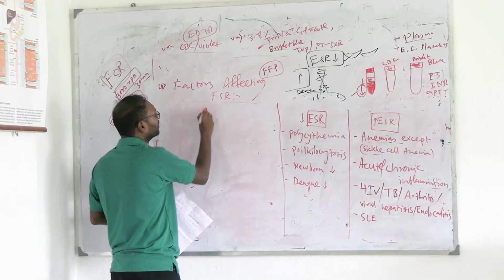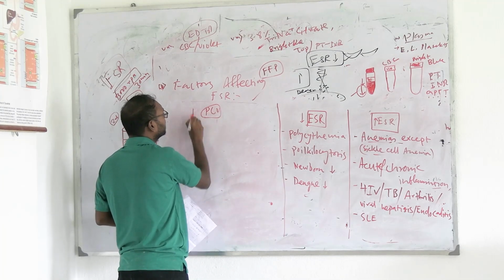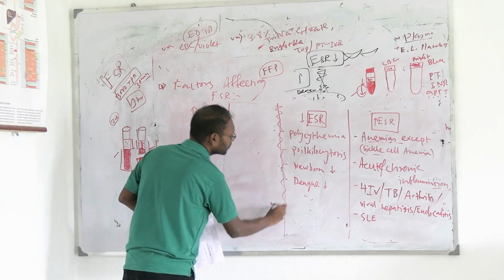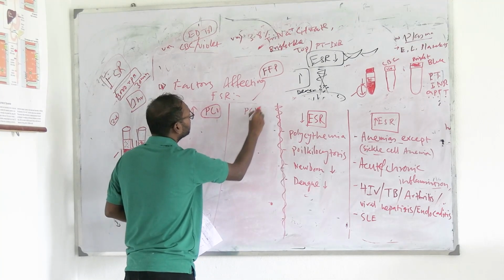So PCV এর ক্ষেত্রে আমরা কি কি দেখব, PCV increase and PCV decrease.